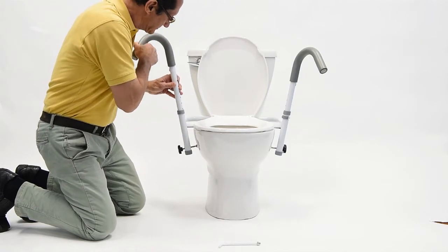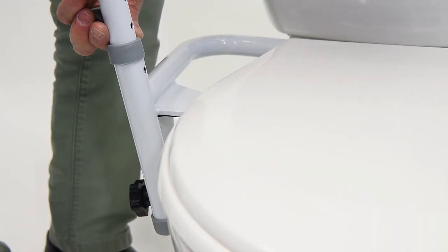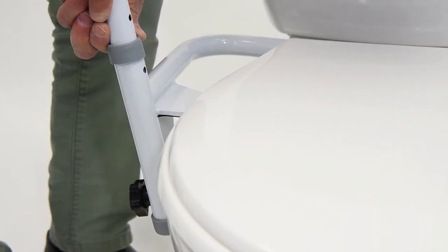Repeat this procedure for the opposite side. To adjust the height for different users or asymmetrical use, repeat these steps until the desired height is achieved.